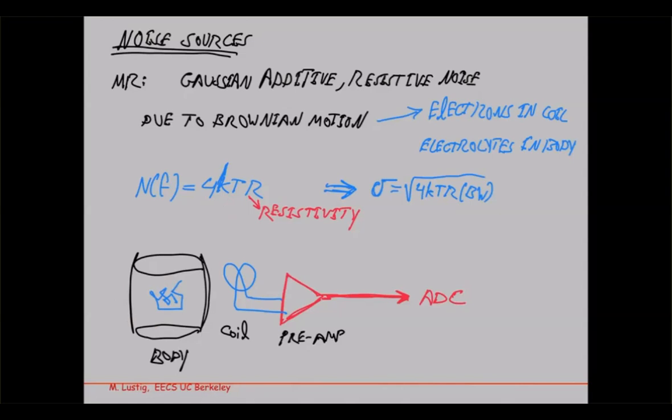So probably not advised. Yeah, I was just thinking about gradient heating and stuff like that with temperature. So the gradient heating, yeah, that can increase the temperature, but it usually increases the temperature of the gradient system, not the receiving system. So not necessarily going to have an effect.